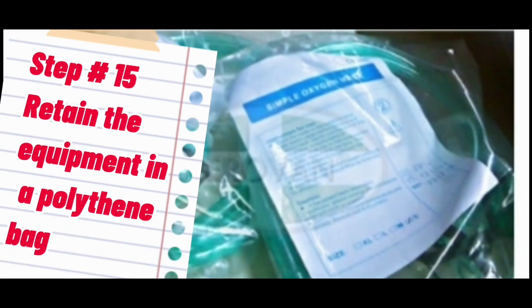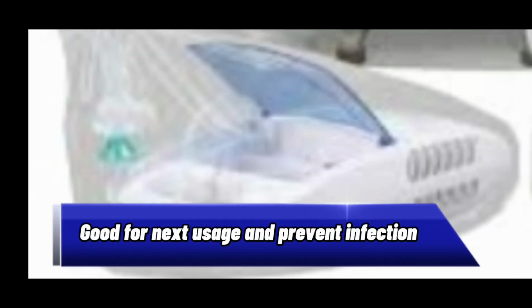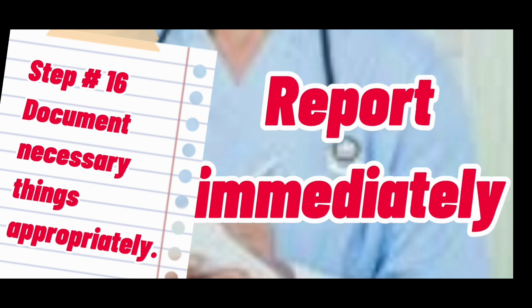Step number 15. Retain the equipment in a polythene bag. Securely clean and dry equipment for next use can surely prevent infection. Step number 16. Document necessary things appropriately, such as nursing practice done. Any adverse effects or any abnormal findings should be reported immediately.